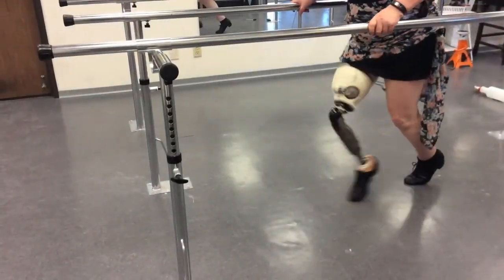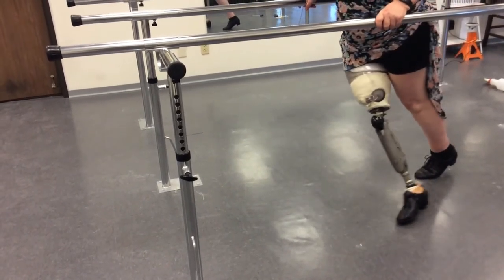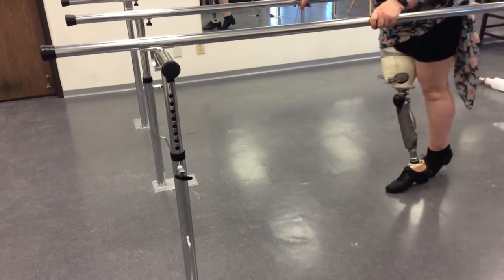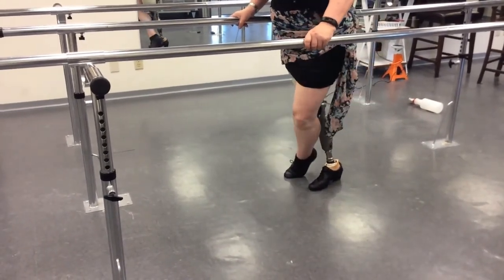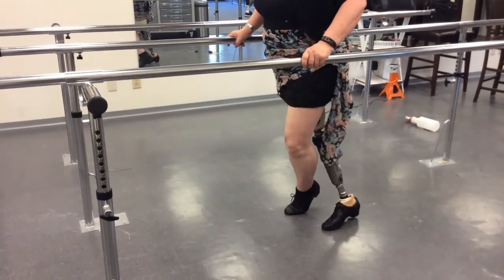And then there's a movement to go like this. If you initiate the bend, then it does a more natural motion. Right, that's what I'm saying. It's doing the more natural motion.